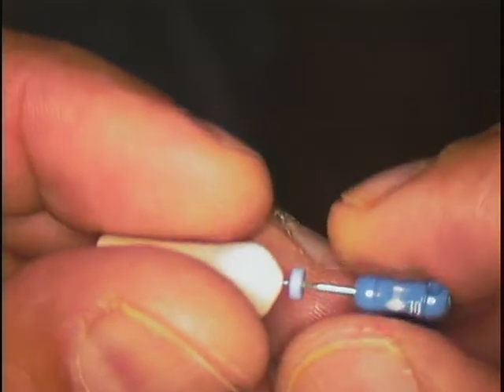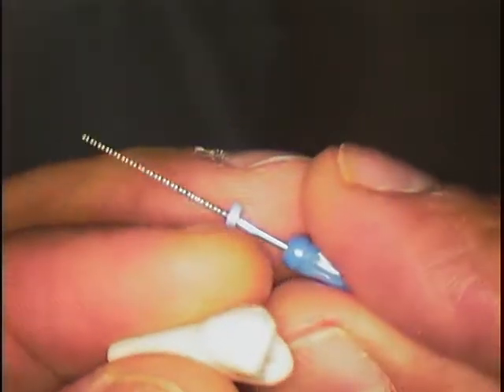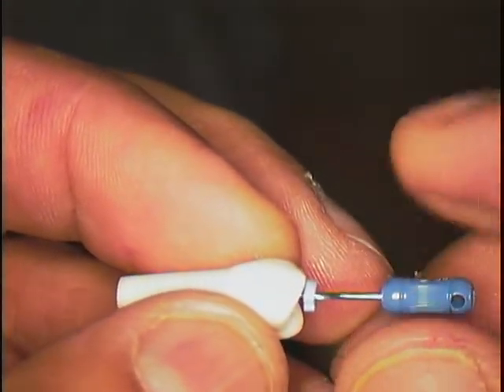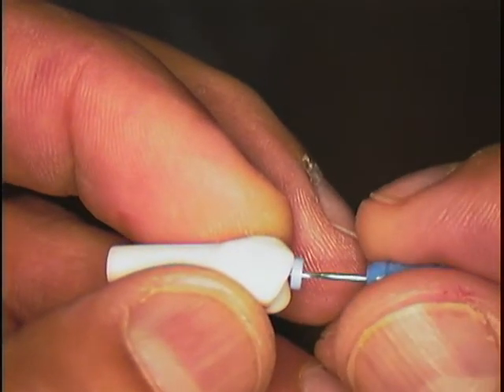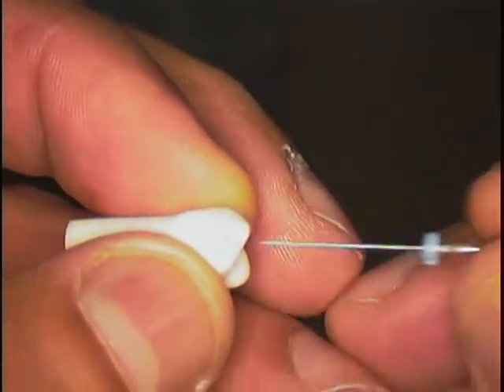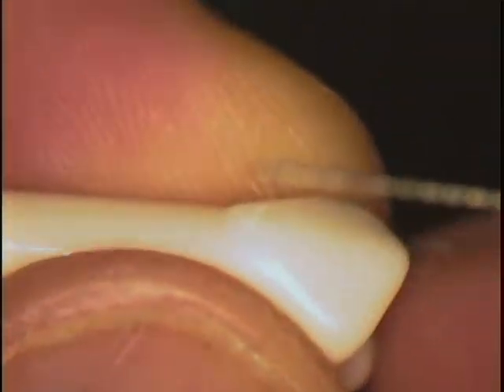And no, that's where it stopped. Right about there. Okay, so I'll make my turn to the right, quarter turn, and then about three-quarters to the left, pull out, check for debris. You won't be able to see this, but you see the red debris here with the microscope, and that means I'm cleaning the side of that canal.